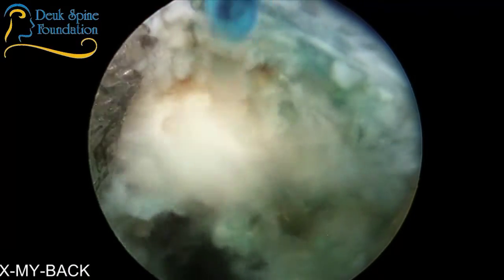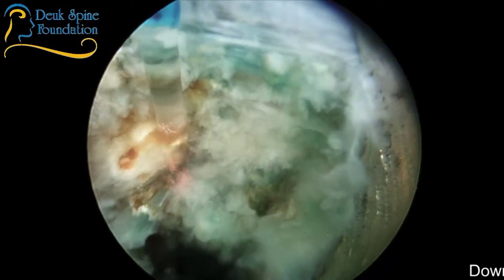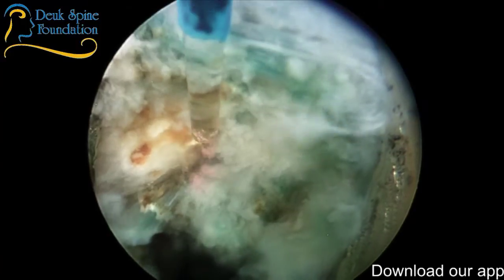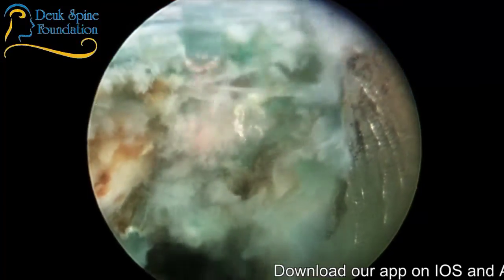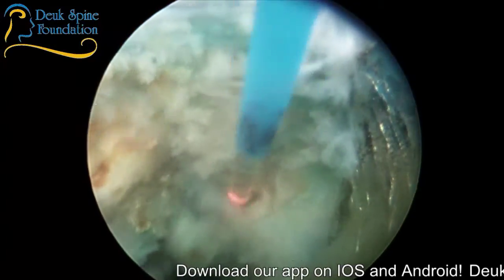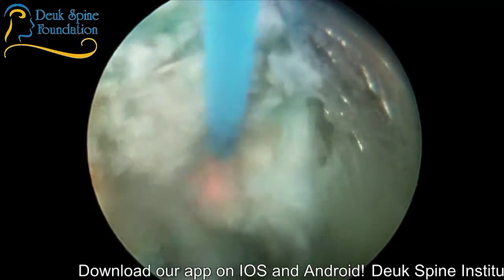Again, only available at Deuk Spine Institute here in Florida. So you can see the end plate right there of L3. That's like a little bone spur back there where I'm pointing. I have a few blast marks in the bone, and this is the last of the tear right here. And I'm going to debride this. And when I'm done, the pain from this disc will be gone forever, unless she re-injures it.